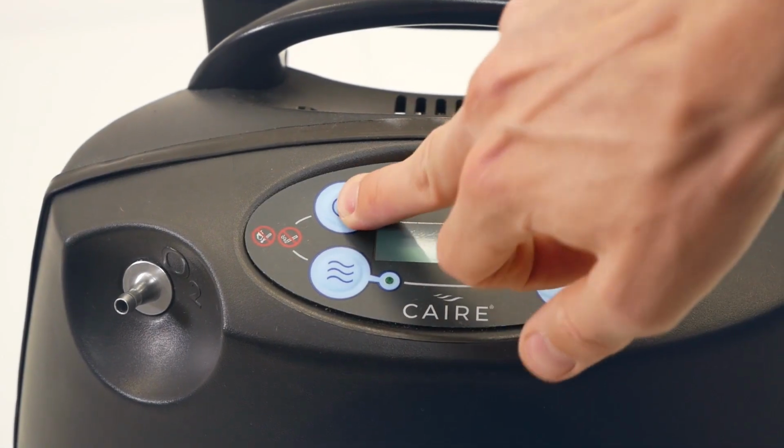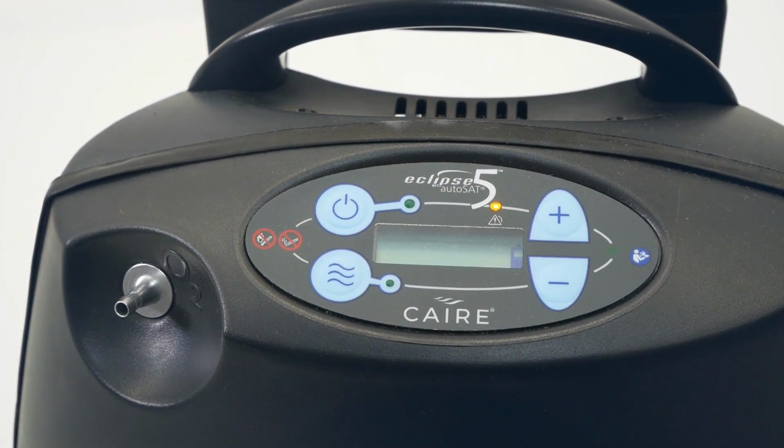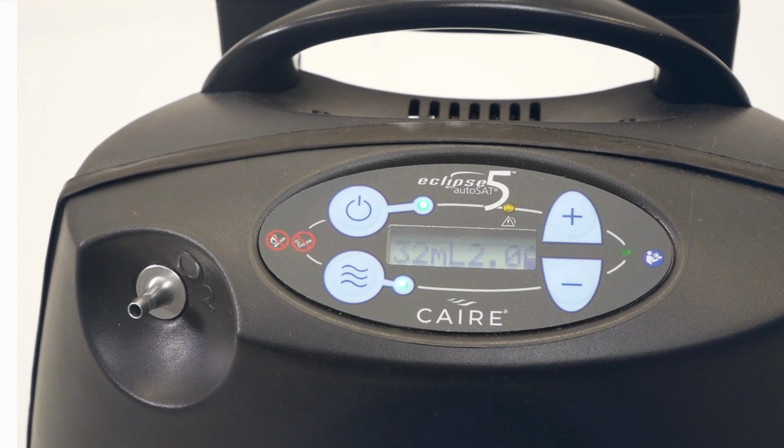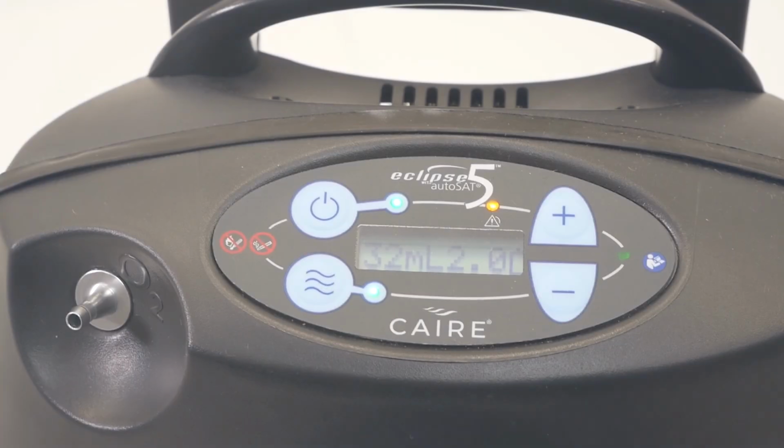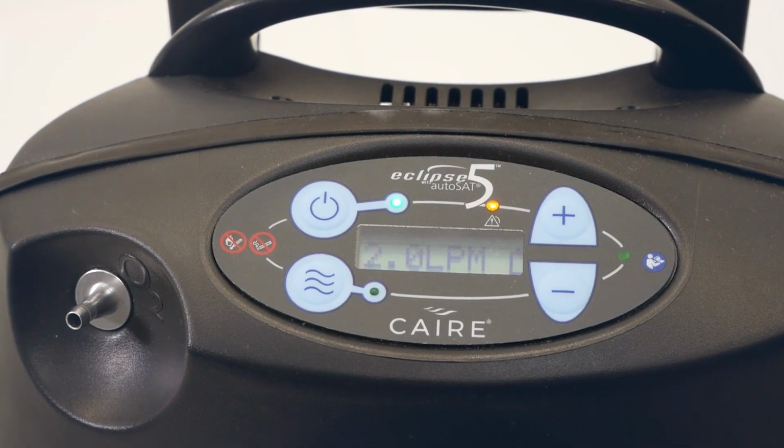The power button turns the system on or off. There is an on-off indicator. The green indicator light is illuminated when the device is powered on. The delivery mode button allows you to switch between continuous flow and pulse dose mode. There is a pulse dose indicator light. This illuminates green once a pulse of oxygen is being delivered with every breath.